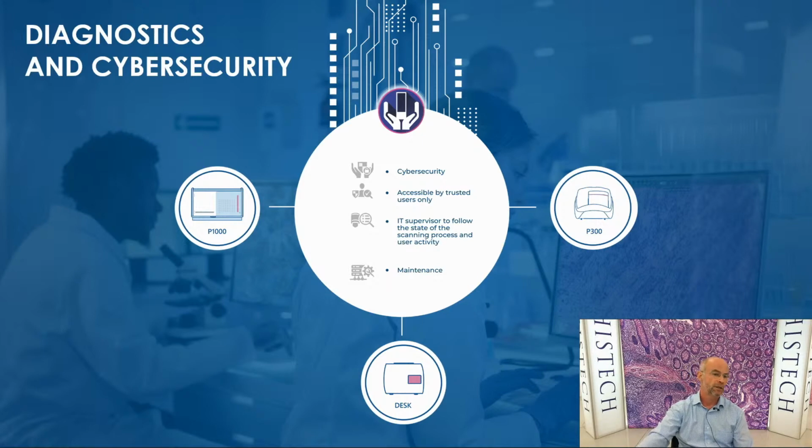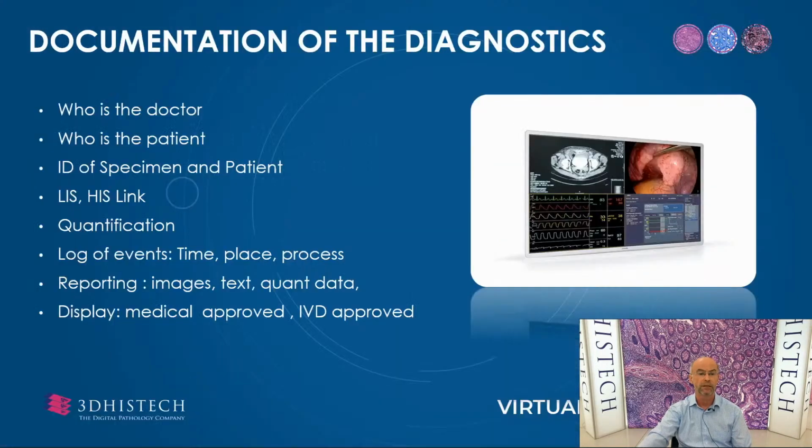And this is something new. This is not digital microscopy anymore. This is not digital slide scanning anymore. This is data, big data, personalized data, sensitive data, where additionally new aspects have to be opened, like cybersecurity, trusted users only, accessibility, and the follow-up of the data management, archiving, and maintenance.